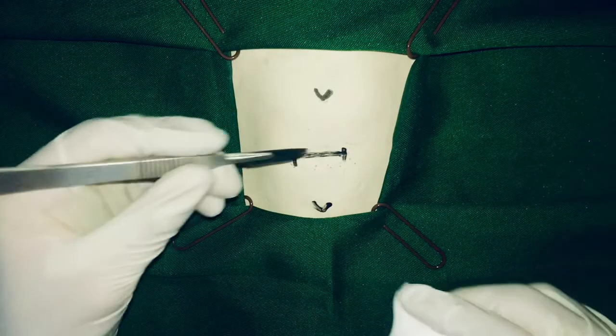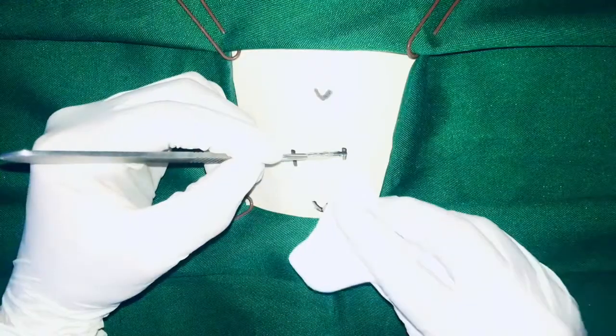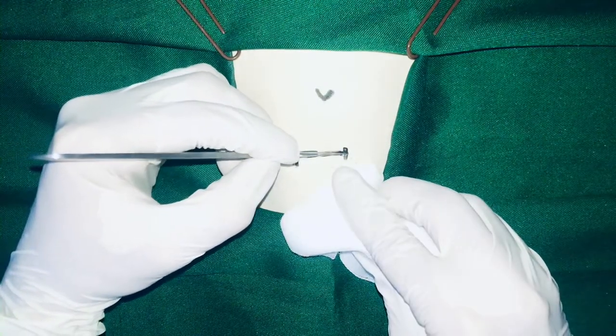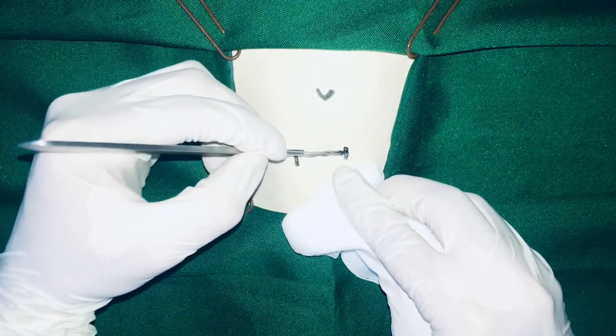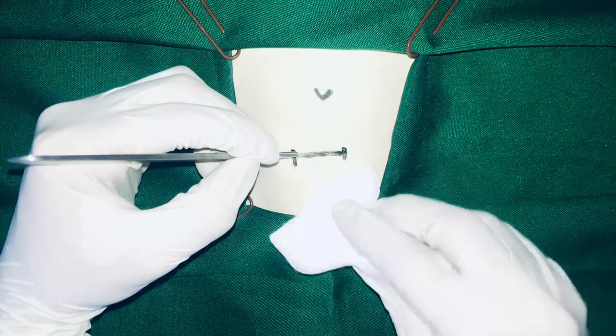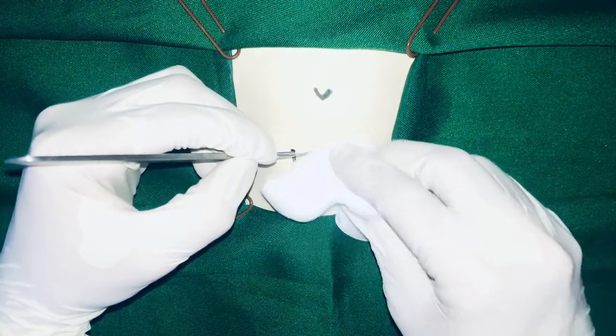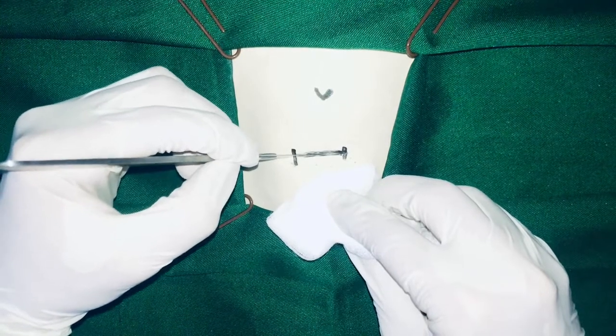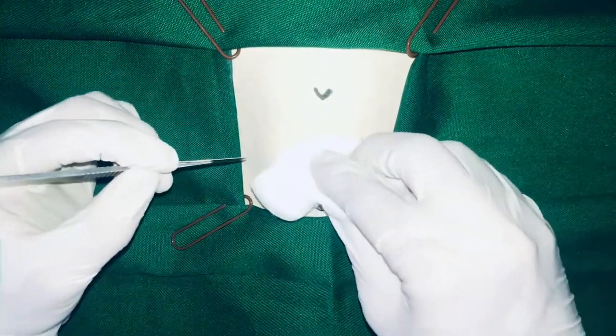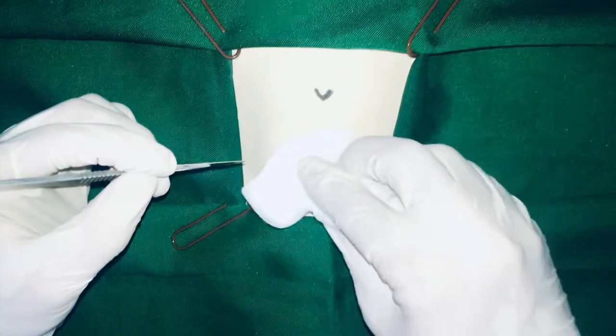Make a horizontal incision, which is cosmetically preferred over a vertical midline incision. Extend the incision to the skin and subcutaneous tissue and the platysma at times, although it is generally absent at the midline. Take care not to transect the anterior jugular veins, which are just superficial to the strap muscles within the investing cervical fascia. They can be preserved and retracted laterally.